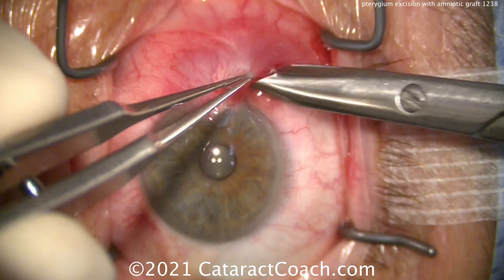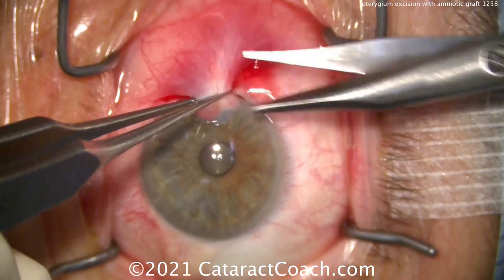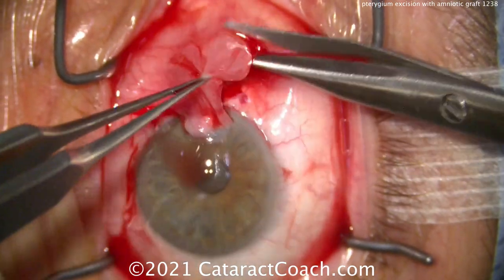This pterygium is causing a lot of irregular astigmatism. So we'll go undermine it and separate that out — and that's very nicely separated. We're going to cut it first, cut the blood supply off, so that we can then peel it off of the cornea. So we'll cut the pterygium.